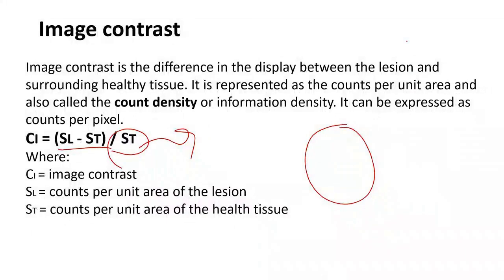Well, can this happen? Yes, it can happen if the radiopharmaceutical labeling you performed does not have a labeling efficiency of more than 90%, meaning it is not sufficient for significant organ uptake. There is a high percentage of free technetium present, and the free technetium increases the background, which consequently reduces the contrast. So does the preparation of the radioactive material affect it? Yes, of course it does.